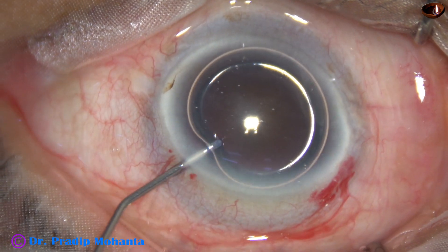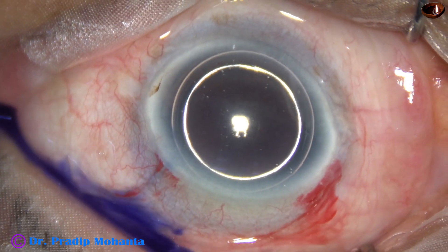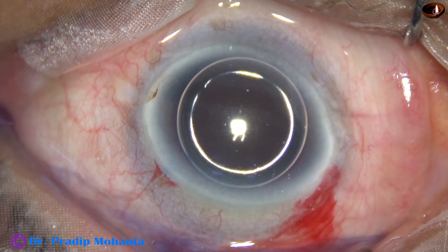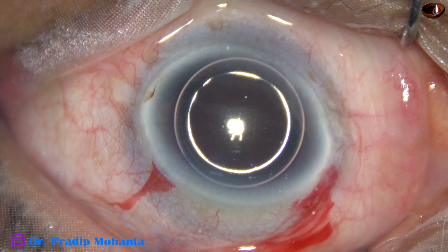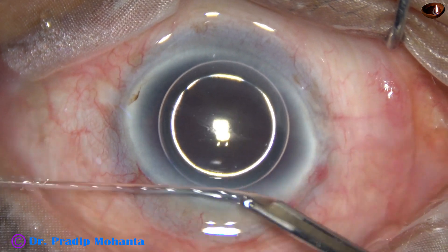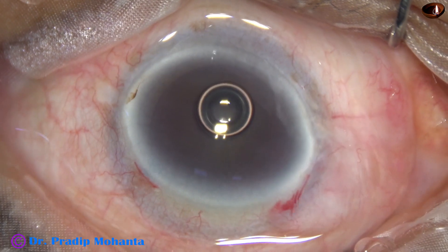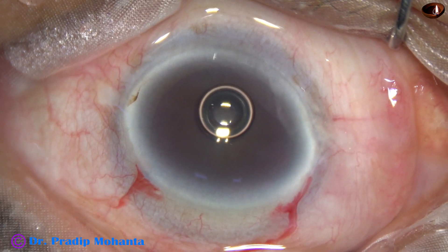And now an air bubble is injected into the anterior chamber. Beneath this air bubble, trypan blue dye is applied over the anterior capsule. This is a bit of adrenaline. And now the dye is washed out. As I do this, I see that the conjunctiva is swelling up.